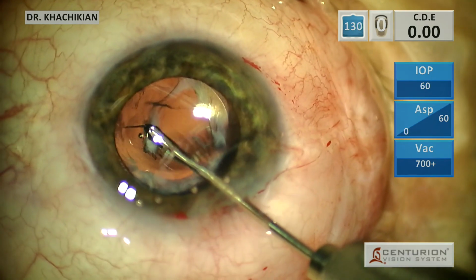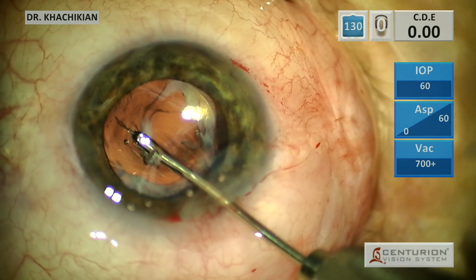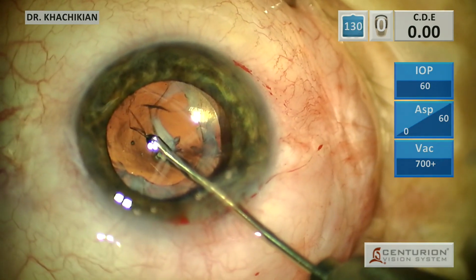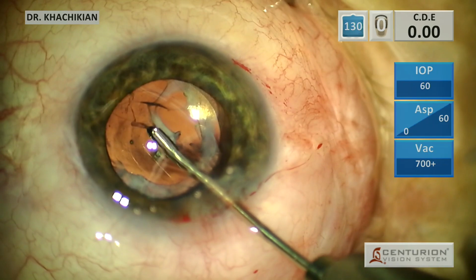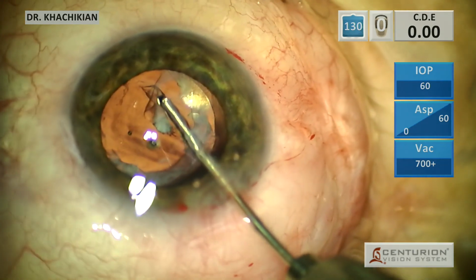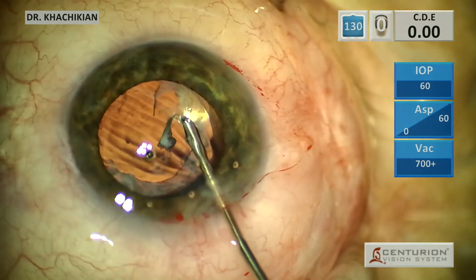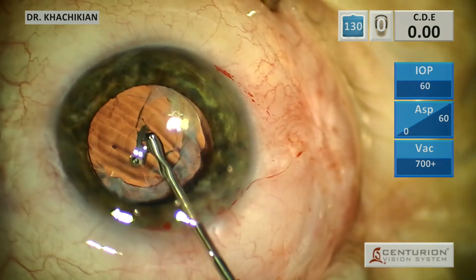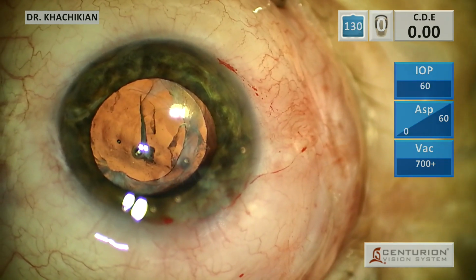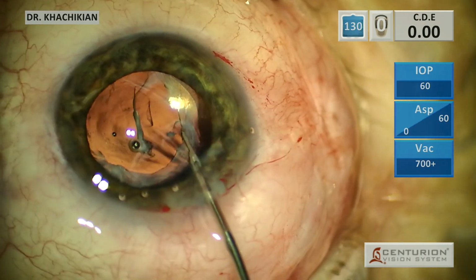So we will recreate this capsular rhexis, do that little maneuver where you pull centrally. Again, it would have been nice if I had reinflated viscoelastic. It probably would have had a more round capsular tear here. Let's just see what we can get. We can get it to the point where we had made that original tear. No. Go back the other direction, or just cut it off. Either way, you removed a large area of fibrosis that might have continued to become phimotic.